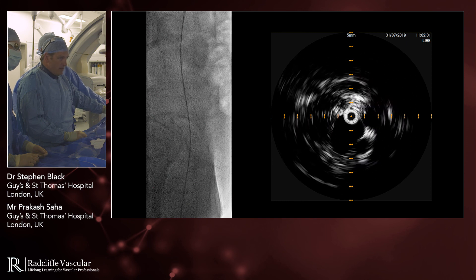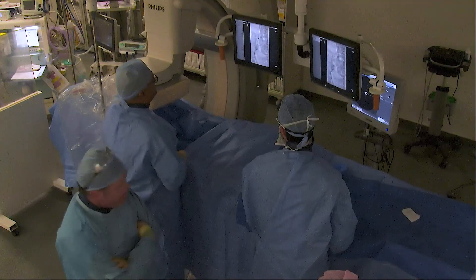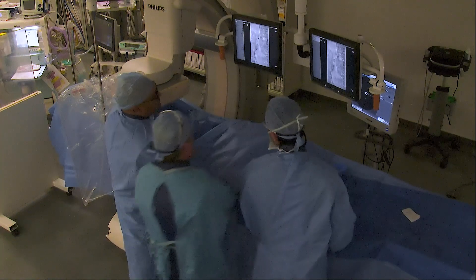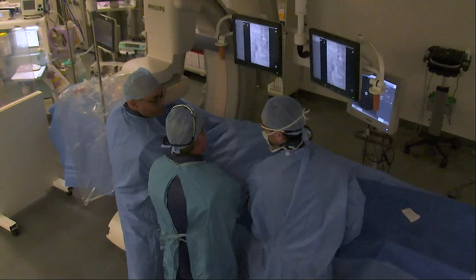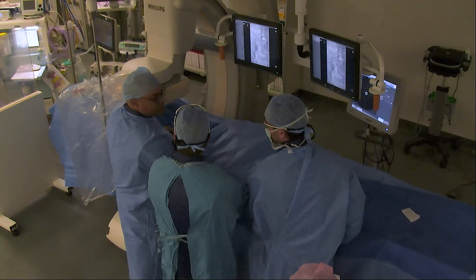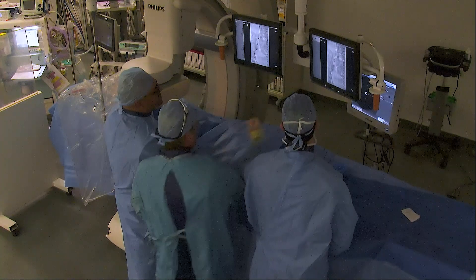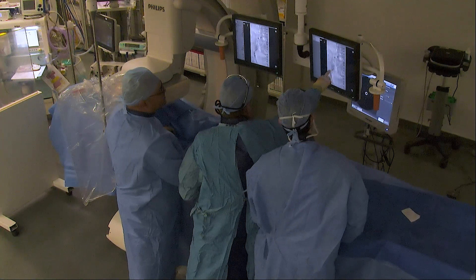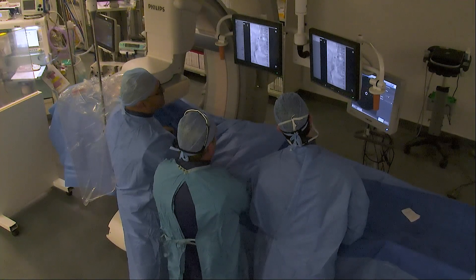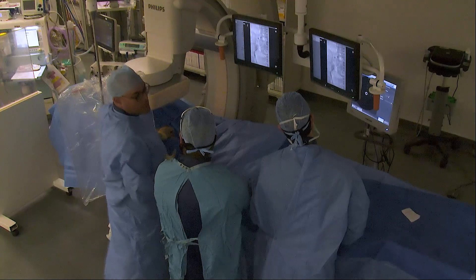So we'll just extend it a couple of centimeters north. In reality, we would have been better off choosing a 14-120 and having the overlap lower, because with it there we wanted the overlap down there. So we could have used a 14-120 and then come around the bend and have the overlap in the external iliac leg properly.